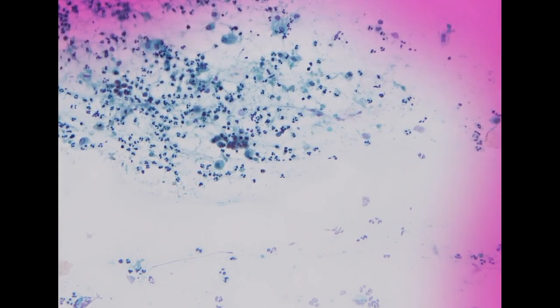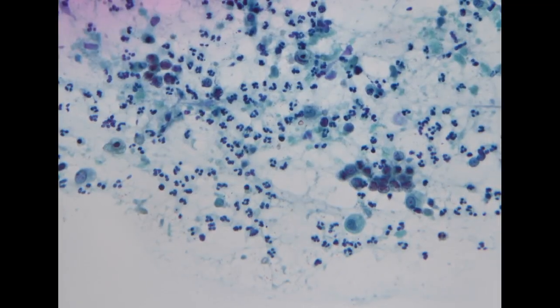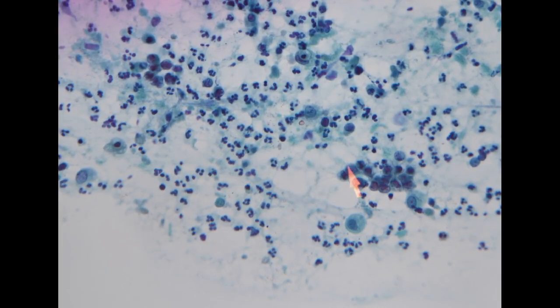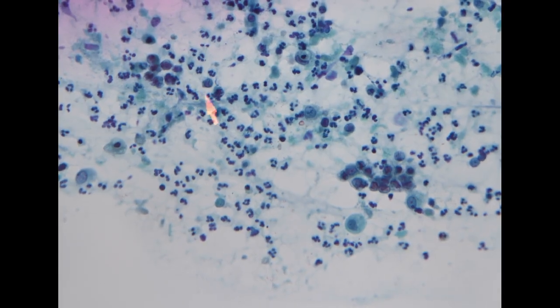So there were a few clusters highlighted by our screener, but these very degenerative, very small cells also look like stromal cells. So stromal cells. We actually didn't see any atypical glandular cell.